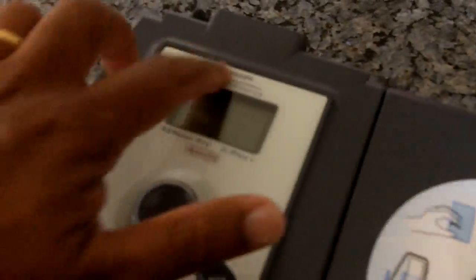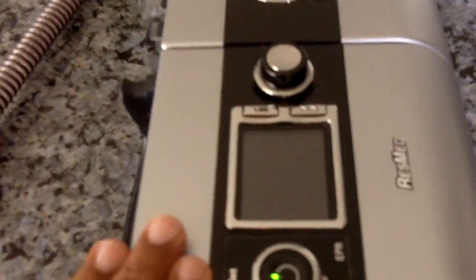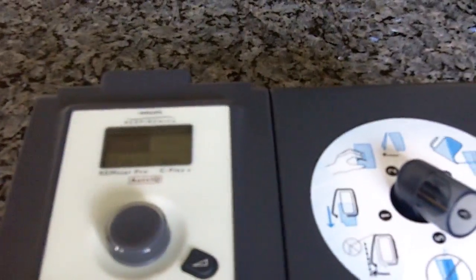Okay? But more importantly, very recently, Philips Respironics came up with this awesome feature that the ResMed unit always had. You can finally preheat the water before you use it. Thank God they finally did that. So let me show this to you.